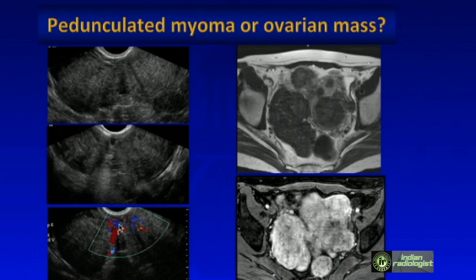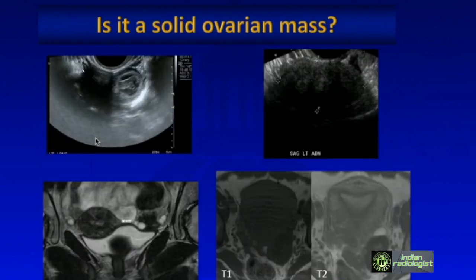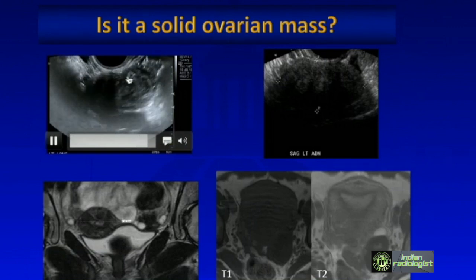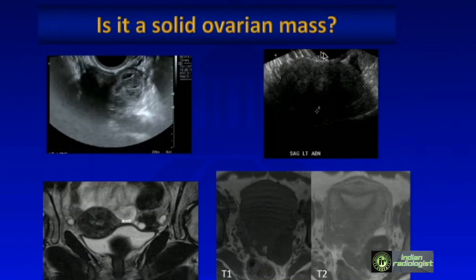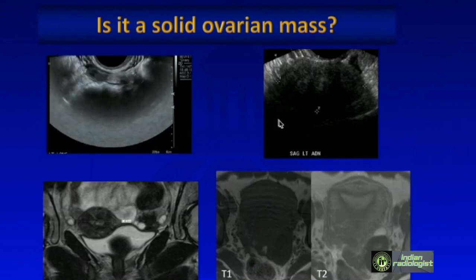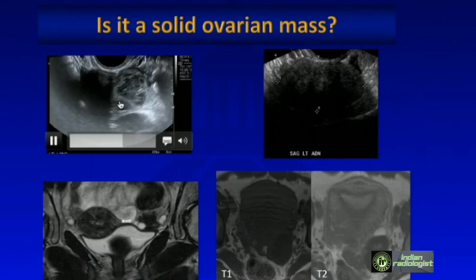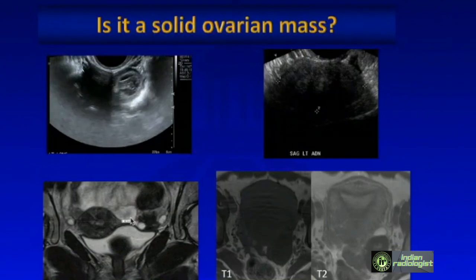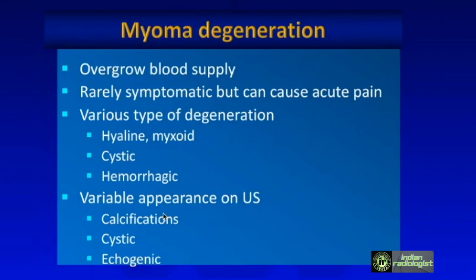On ultrasound it can be difficult to distinguish a pedunculated myoma from an ovarian lesion — the first thing to do is try to find the ovary separate from the lesion. These lesions here were actually ovarian fibromas — you can see they are part of the ovary. MRI confirms a normal uterus with a low signal intensity lesion consistent with an ovarian fibroma.